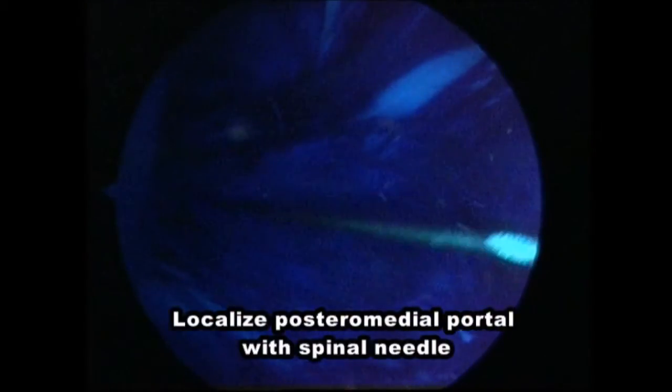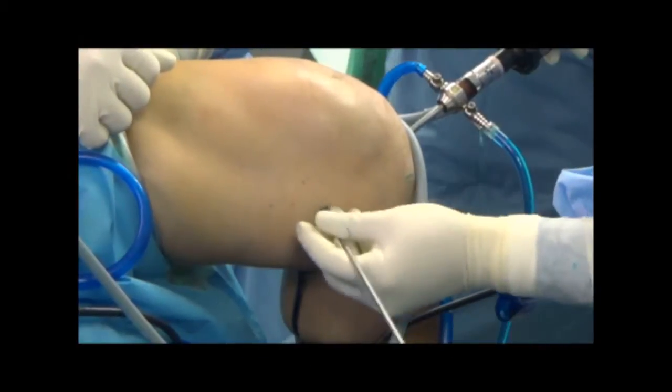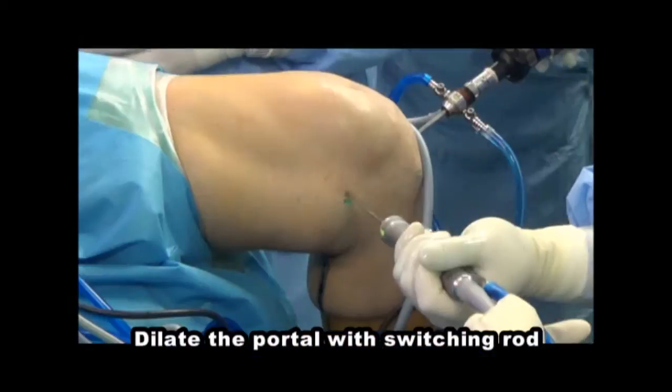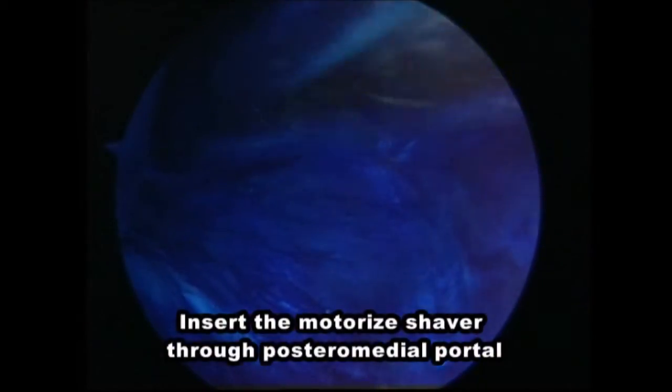The needle is used to locate the position of the posteromedial portal. We then dilate the portal with a switching rod, and the motorized shaver is inserted.